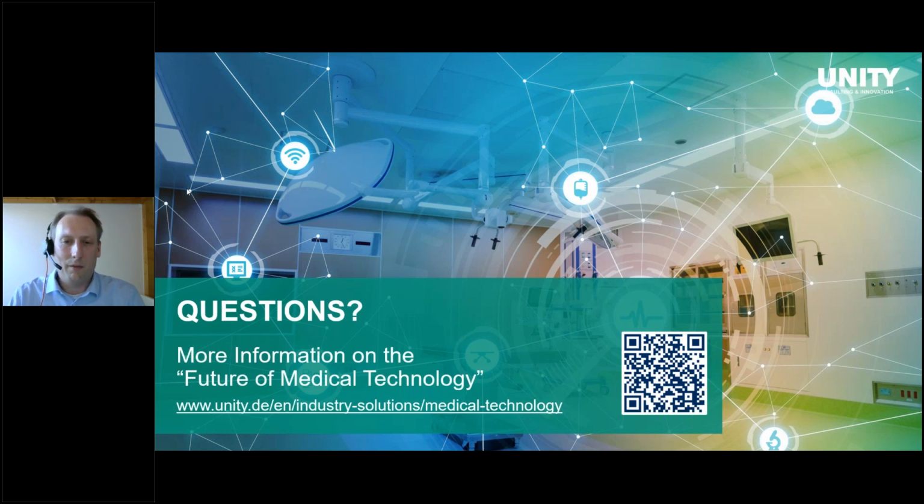with colleagues from Philips, Draeger, from the OR.NET consortium, and we do a mapping on how the SDC data can be easily mapped to the FHIR resources, so that later if someone wants to implement this, they don't have to figure it out by themselves, and maybe the mapping to FHIR wouldn't be interoperable anymore, but this is why we work on this implementation guide.